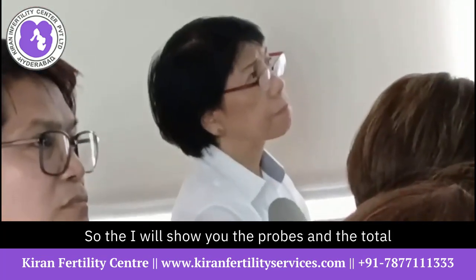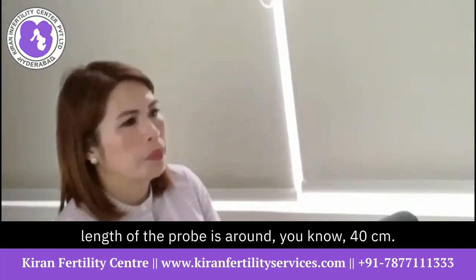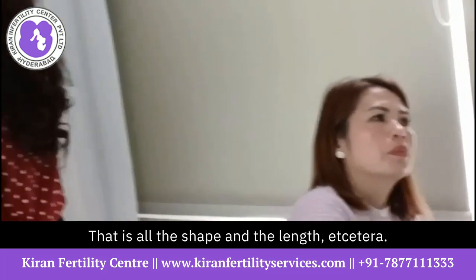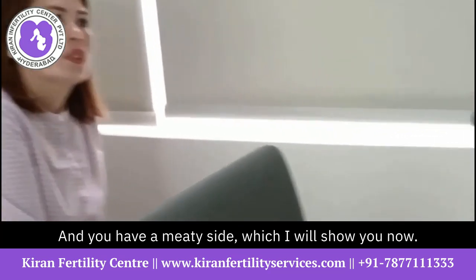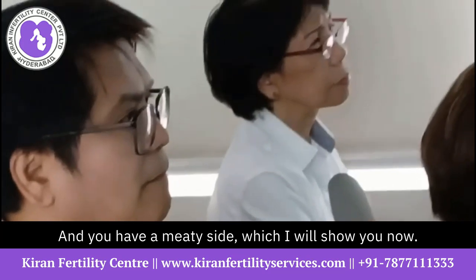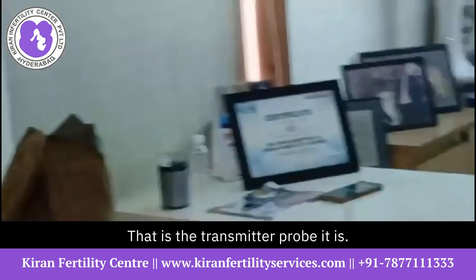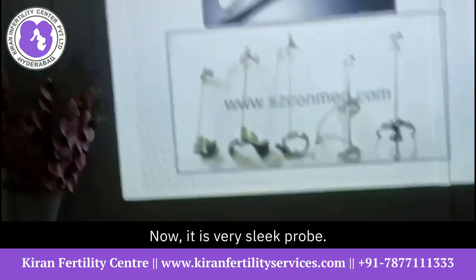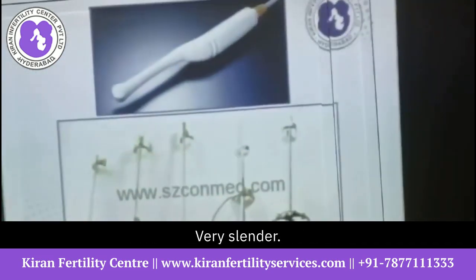So I will show you the probe. The total length of the probe is around 40 centimeters. That is all the shape and the length, etc. And you have a needle guide which I will show you. Now can you see the probe there? Yes. That is the transvaginal probe. It is nowadays a very sleek and very slender probe.